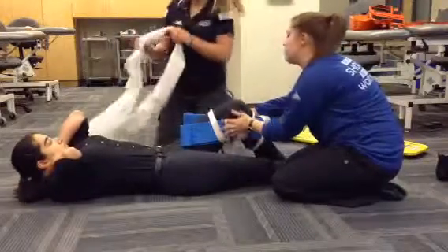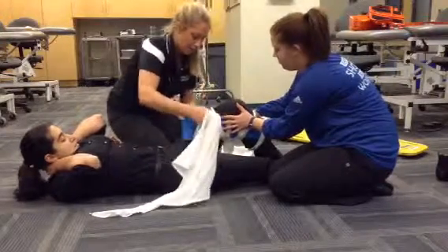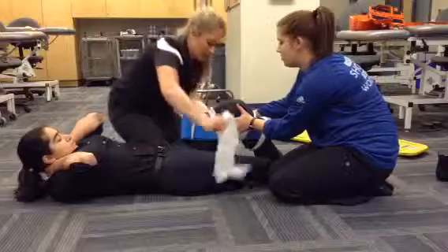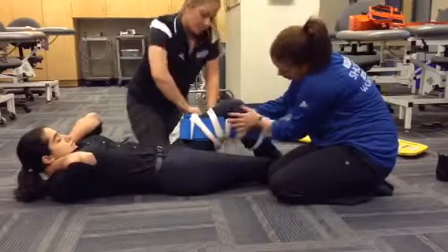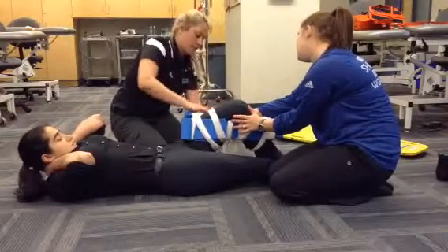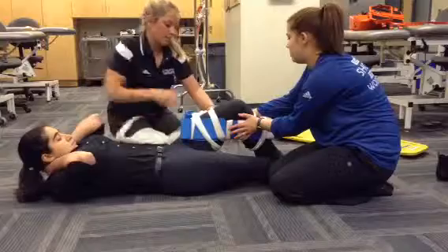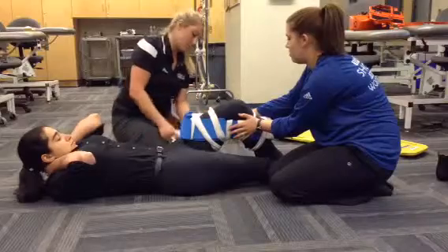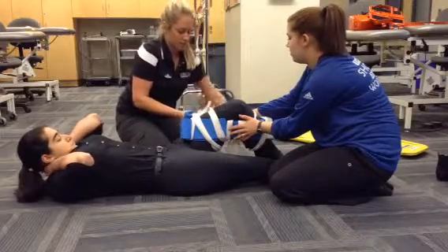Next we're going to take a doubled-up triangular bandage for extra length. We're going to come below first, come over top, switch underneath and tie on the side. We're going to tuck in the ends.